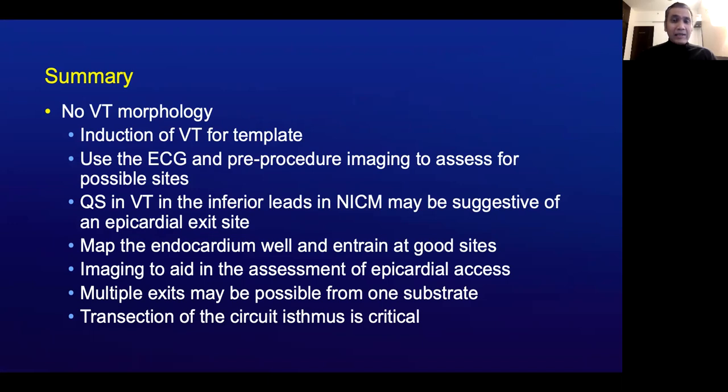Imaging to aid the assessment of epicardial access, both pre-procedure and intra-procedure, is critical. Multiple exits may be possible for the ventricular arrhythmia from one single central substrate, and transection of the circuit isthmus is critical to achieve durable freedom from arrhythmia long term.